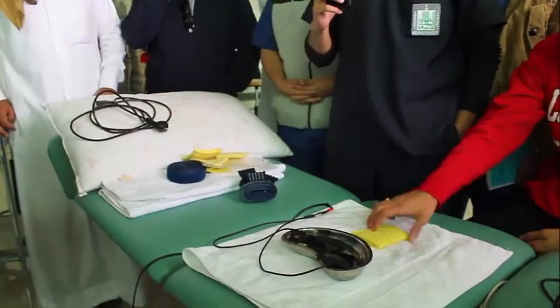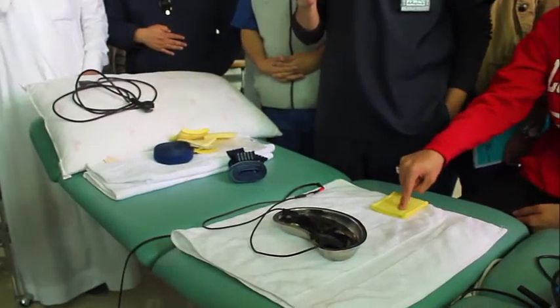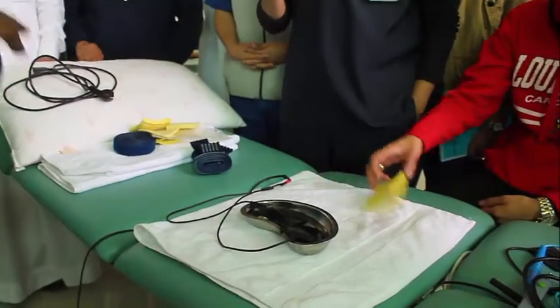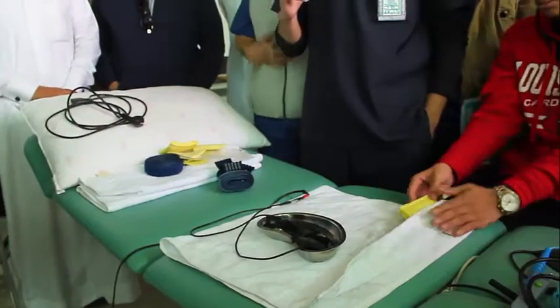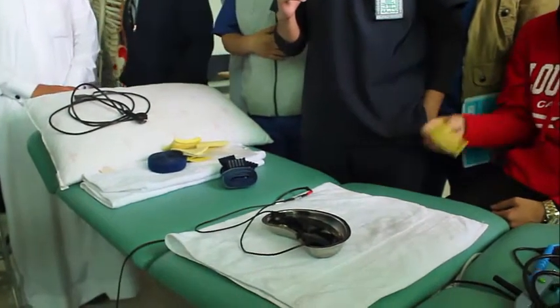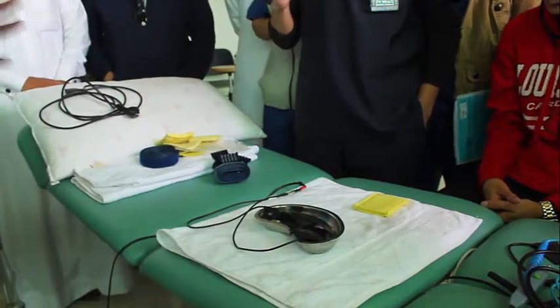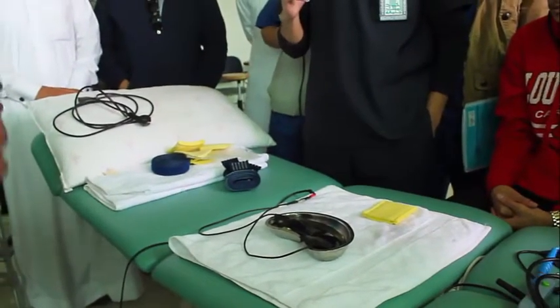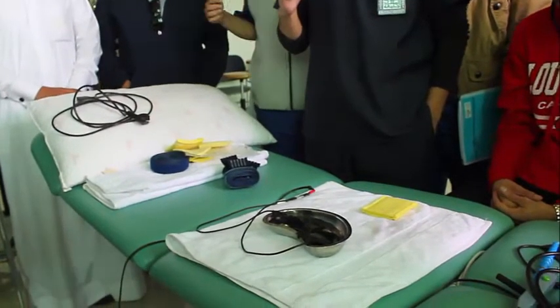Okay, so cathode has to be on the muscle if you want to stimulate better. When you keep anode also, same thing will happen. Anode will pull more positive ions from inside the cell, but the problem is cell permeability. Cell does not permit positive ions to go outside that easily. So you can still stimulate, but the effect of stimulation is usually weaker when you put anode on the nerve than cathode on the nerve.